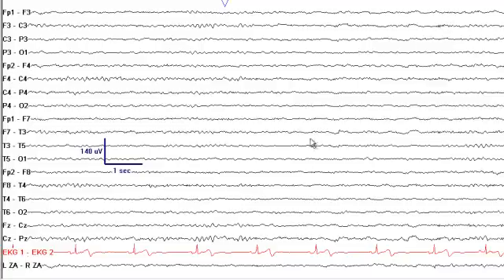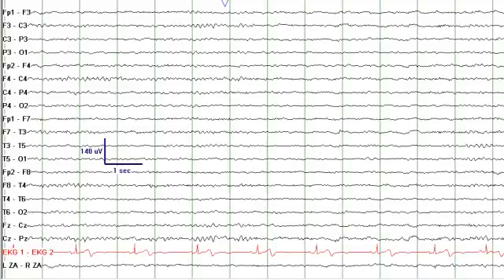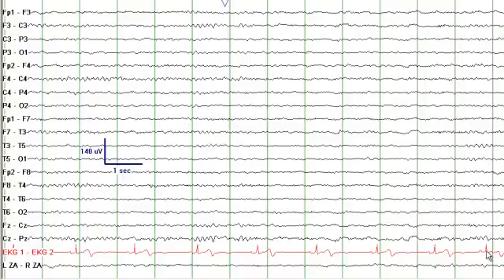When looking at an EEG, make sure you also look at the heart rate. Between the dark green lines is 1 second. Taking 10 seconds and counting the number of QRS complexes gives approximately 8 complexes, which times 6 is approximately 48 beats per minute.